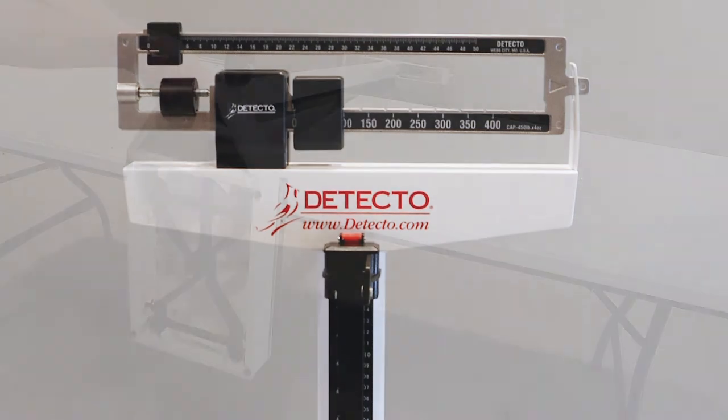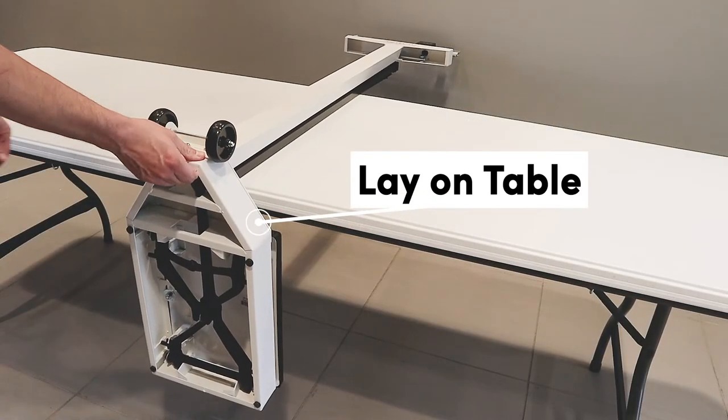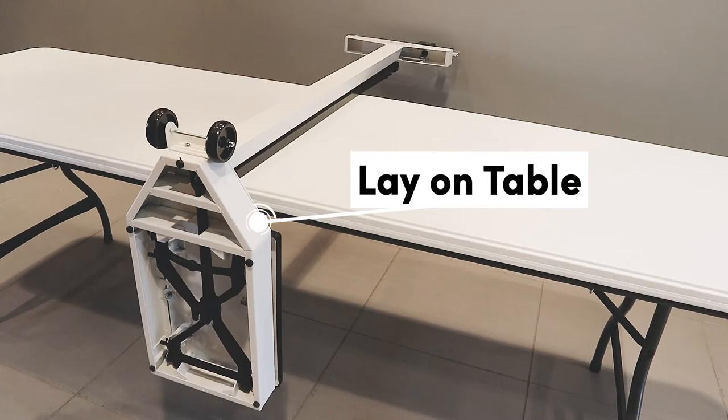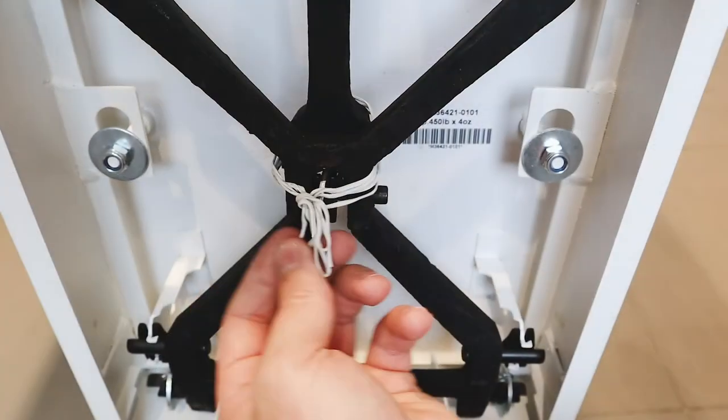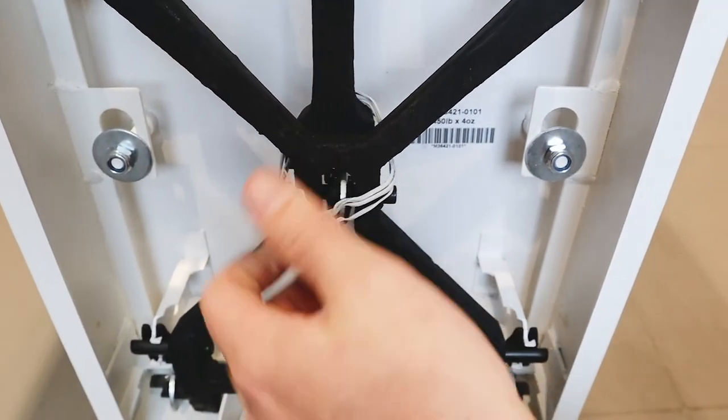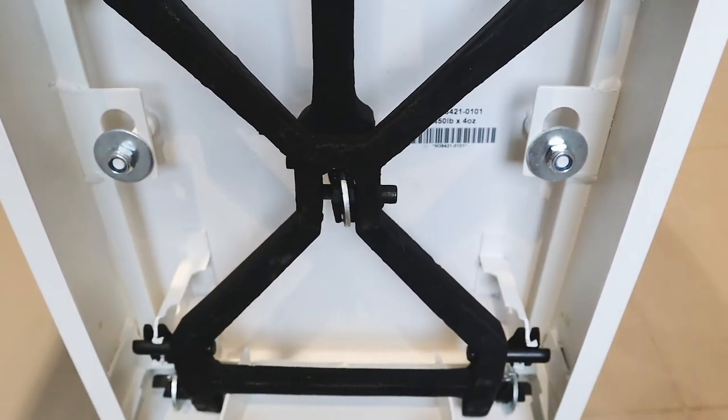Lay the scale on the table or workbench with the scale base hanging over the edge of the table or workbench to access the bottom of the scale base. Remove and discard the shipping tie wrap wires on the underside of the scale base.